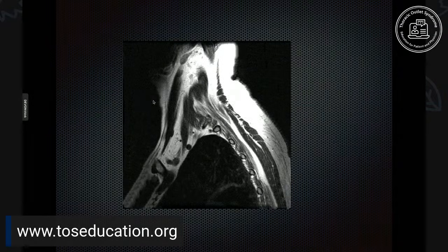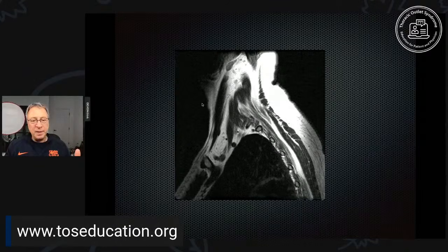This is a different MRI slice where the fat is white, the muscles are dark gray, the bones are white in the middle with a black shell around them. You can see an artery, which is just a black circle, a vein, which is just a black circle, because in this particular type of MRI, the blood vessels are left to be dark.